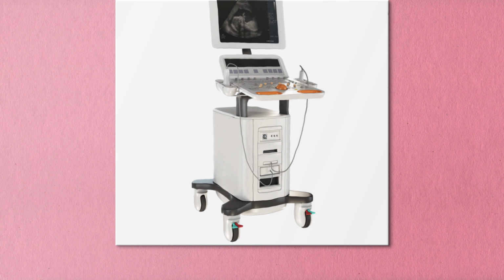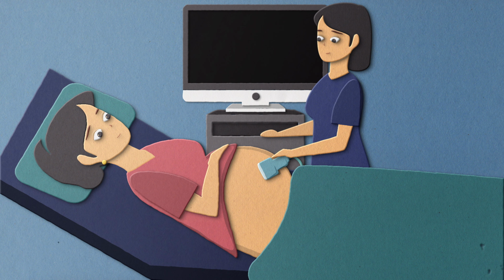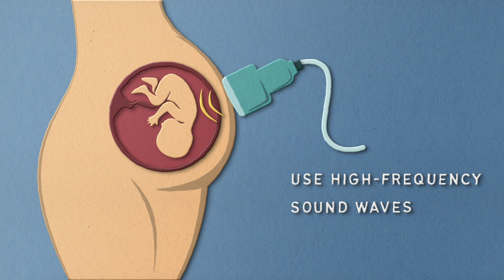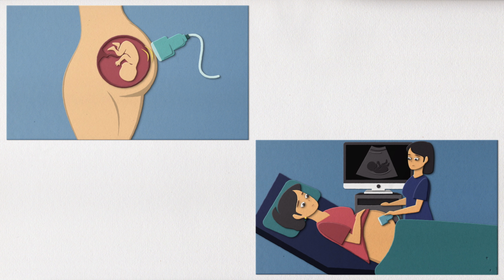We couldn't talk about medical imaging without mentioning ultrasound. People usually associate ultrasound to pregnancy follow-ups, but due to their non-invasive and non-radioactive nature, they have become very useful in a wide range of diagnostic procedures. Ultrasound probes use high-frequency sound waves, well above the threshold for human hearing, that echo off structures in the body. These reflected waves are then captured by a computer, creating an image.